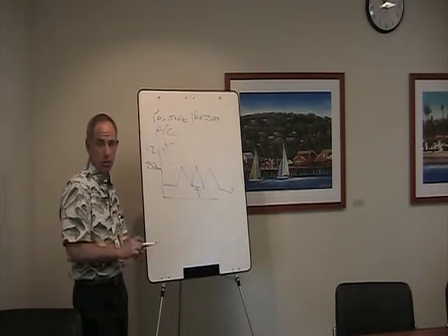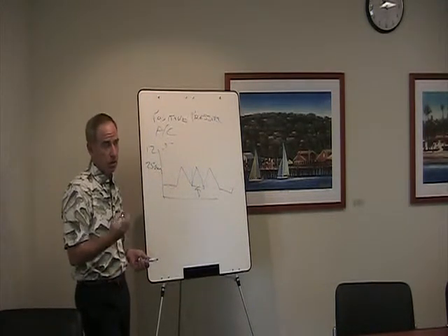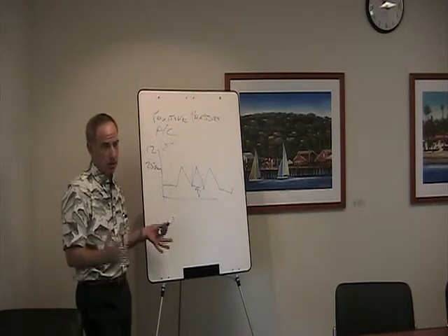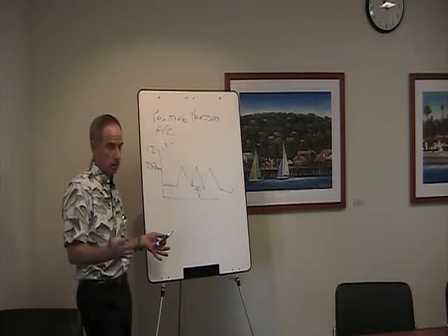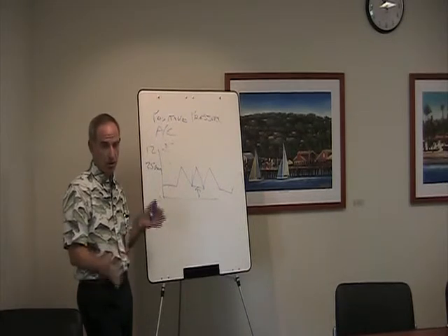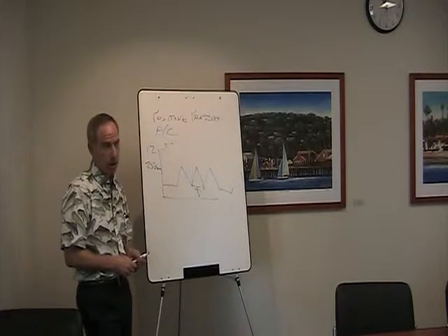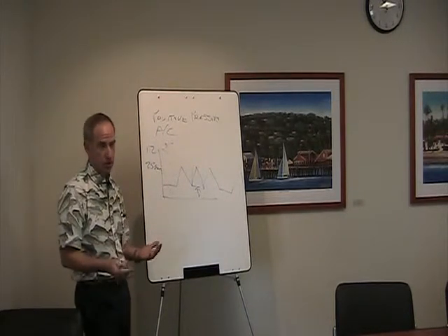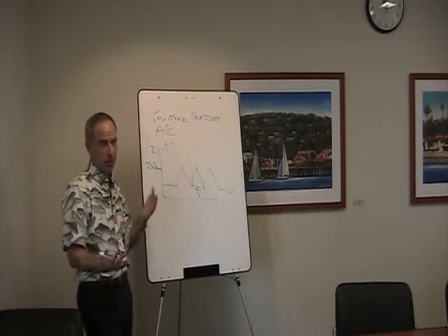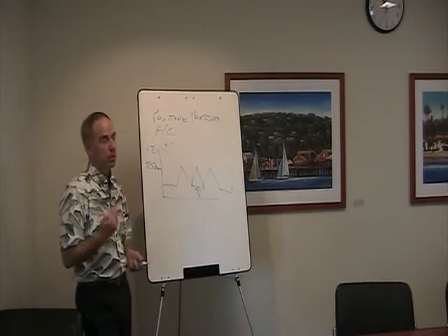So it depends on two main things: compliance and what's the other thing? Resistance. So anytime you think about ventilation, any kind of ventilation, you need to keep those two things in mind: lung compliance, lung/chest wall compliance, and resistance. Because those are the factors that are going to affect how well you're going to ventilate your patient. And they're also going to affect changes, so that if somebody decompensates suddenly in the middle of the night, that's what you need to think about. Is this a change in resistance, compliance, what's going on here?